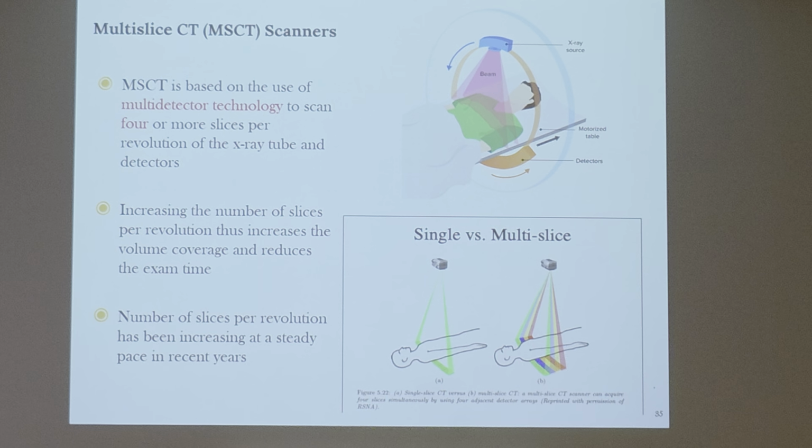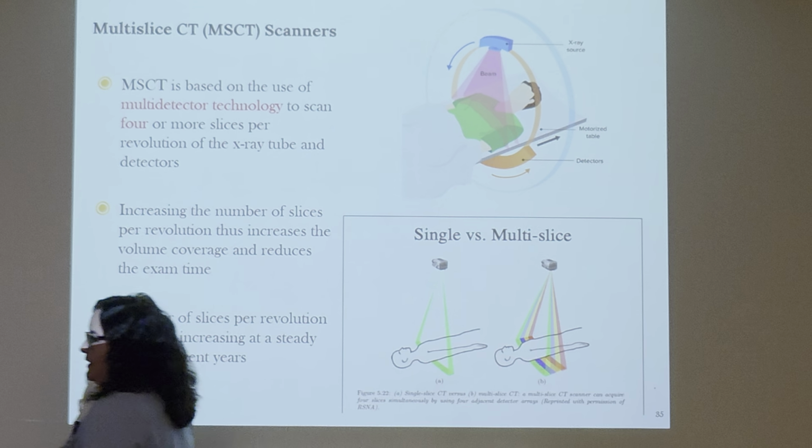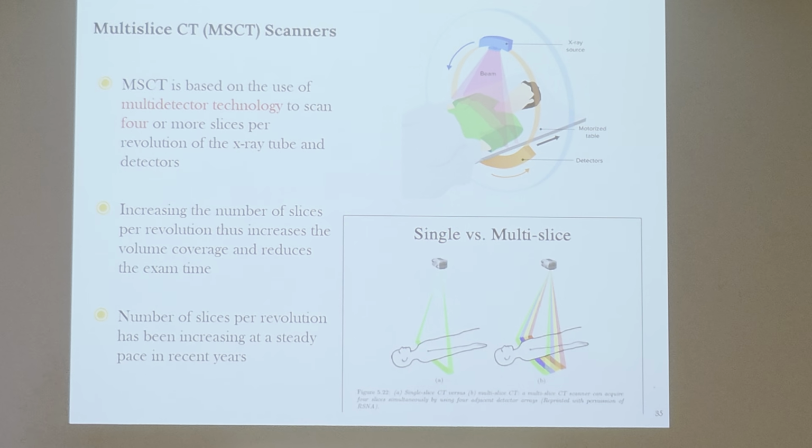So if you had a pencil beam and a small detector, let's just call this 5 by 5, don't remember that, but you just doubled it, that's a multi-detector, right? We talked about that. This is a bit different. This one was side by side, and we saw in generation what? Very good. You guys are coming with me, see? This is different. Now what's happening with the detectors?